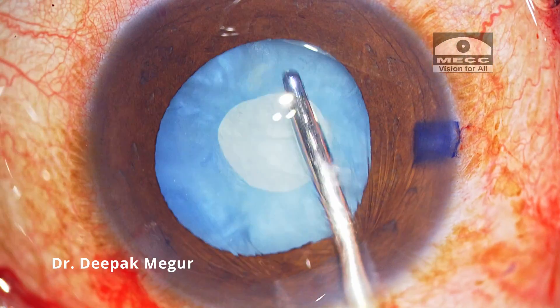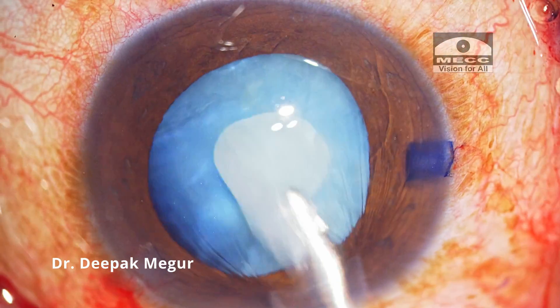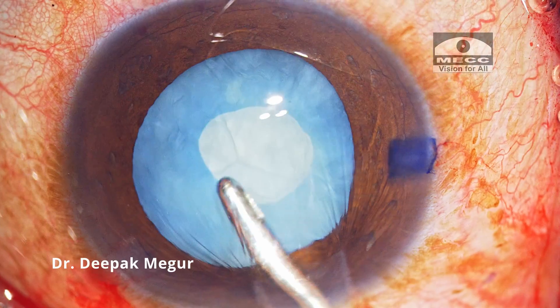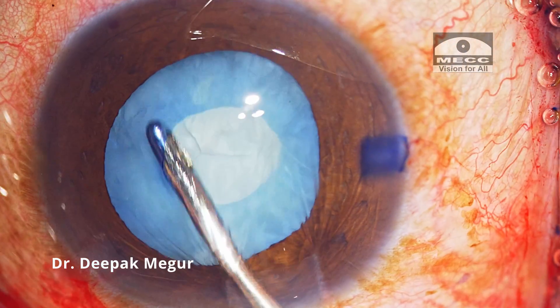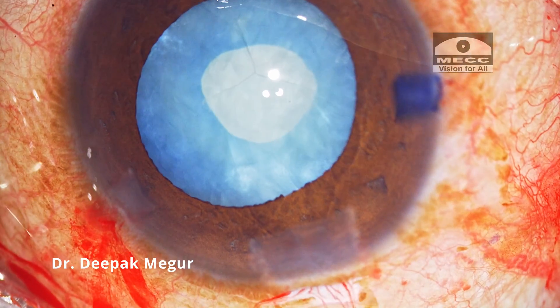These corneal folds are indicative of that aspect. By keeping the incision open, we prevent pressure build-up in the anterior chamber and hence minimize the risk of capsular block syndrome. One needs to be mindful of this aspect while performing passive irrigation through a very small rhexis. In a couple of minutes, most of this swollen cortex is irrigated out.